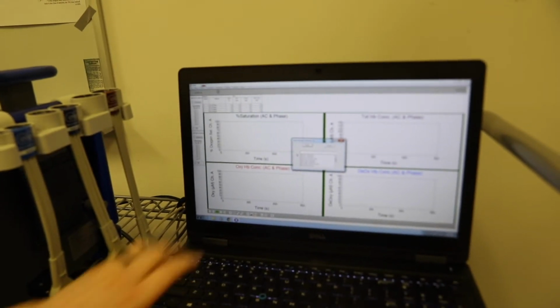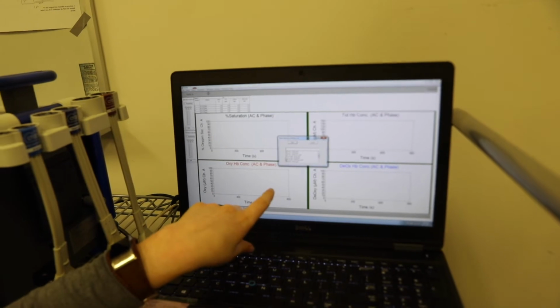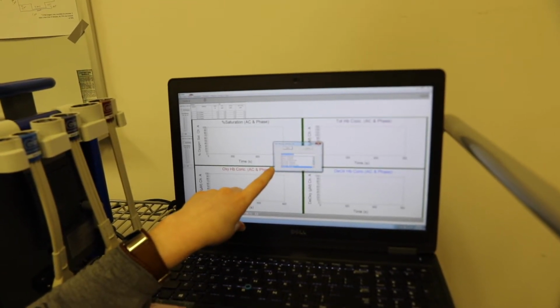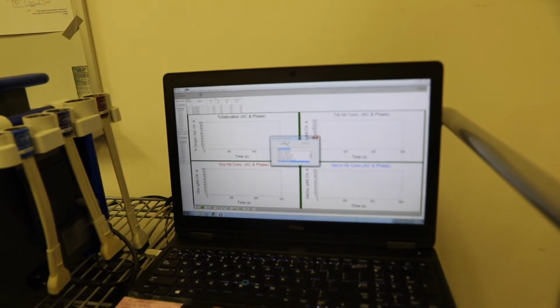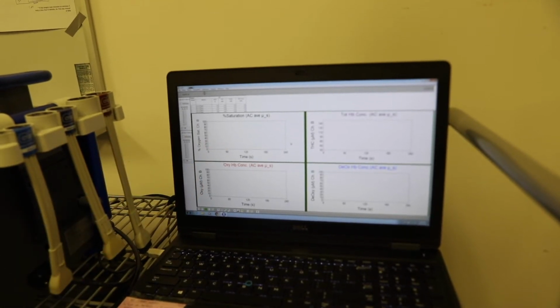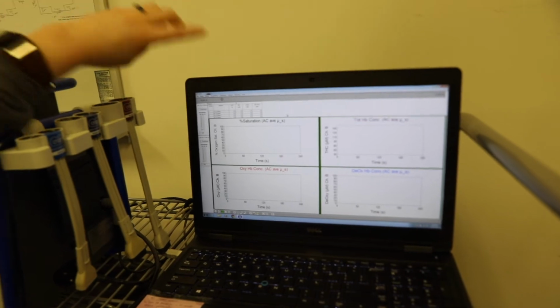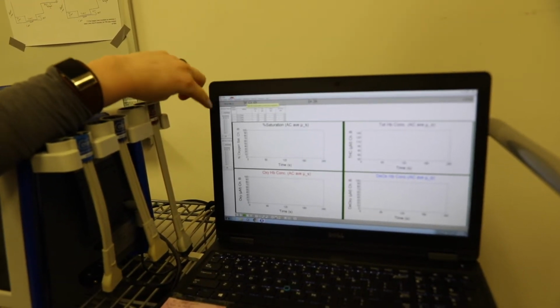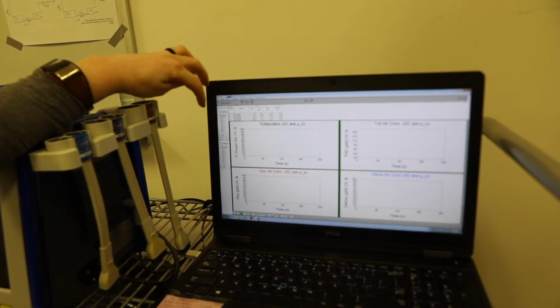And we want to switch these graphs that are being monitored to probe B. So just click on this bottom one without scrolling or anything. It should just be this bottom one. Click on that and click on open, and it switches the graphs to be on probe B. Now to start calibrating, the first thing we have to do is come up here and click on this button to start it.